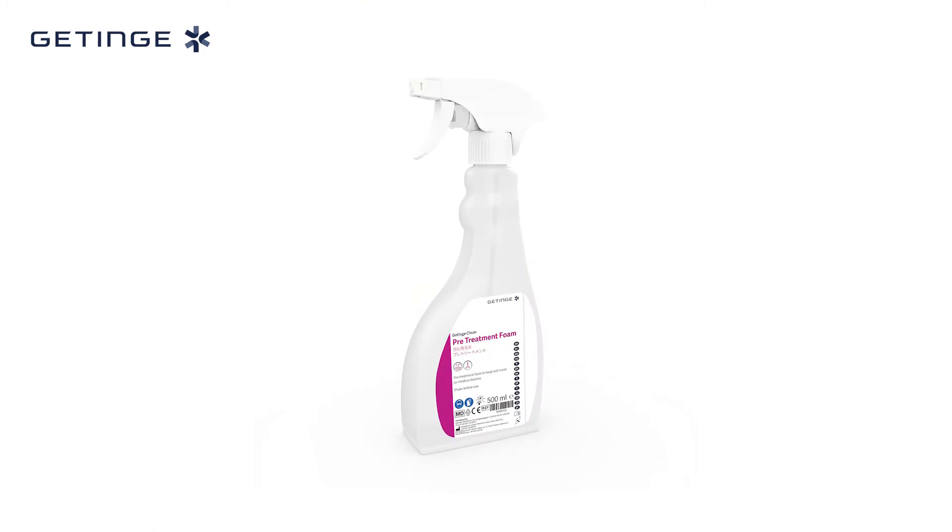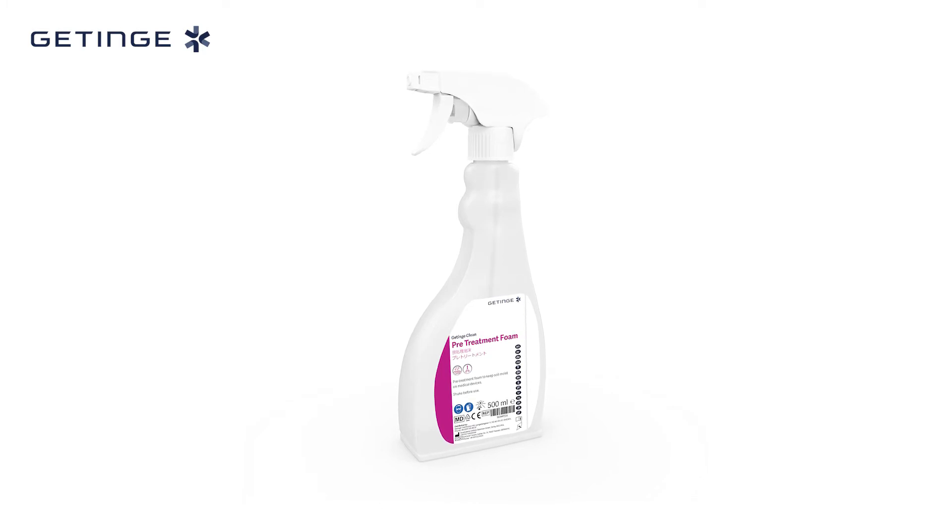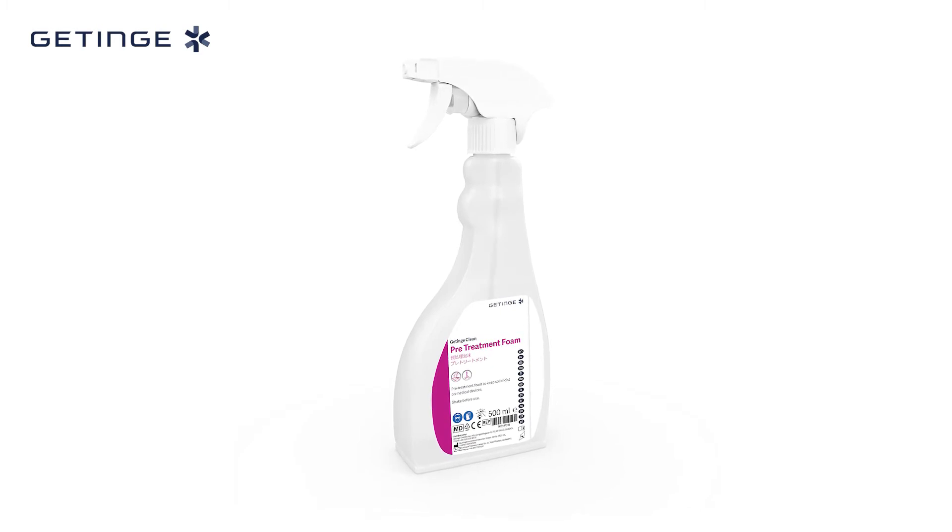When a pre-treatment foam is applied immediately after instruments are used in the OR, the spray can keep them moist prior to transportation. Pre-treatment foam provides an easy and safe method for your medical devices to be ready for the next cleaning phase.